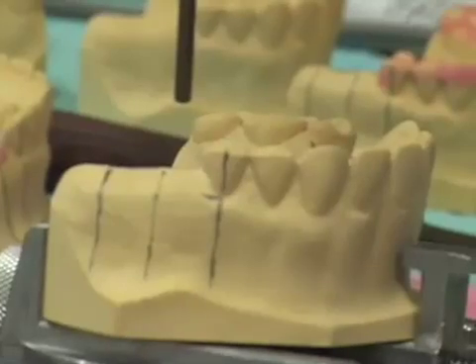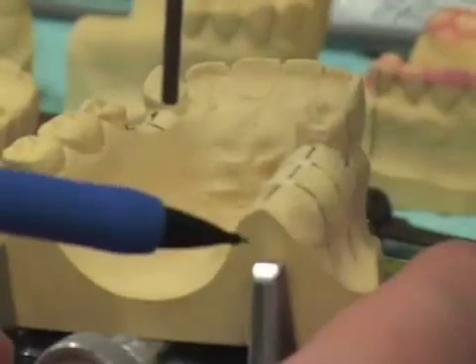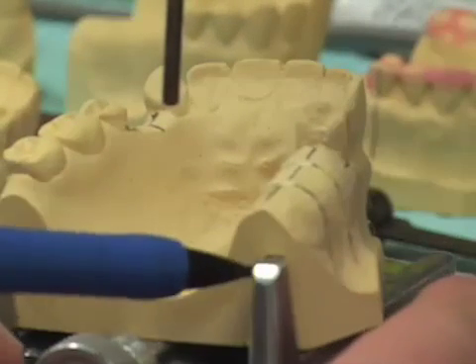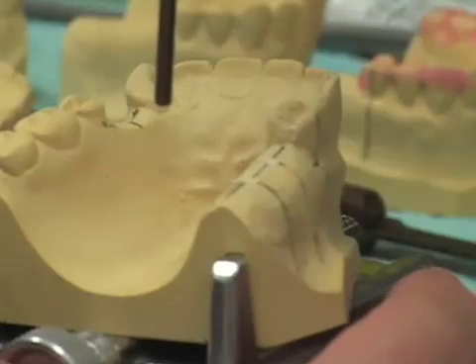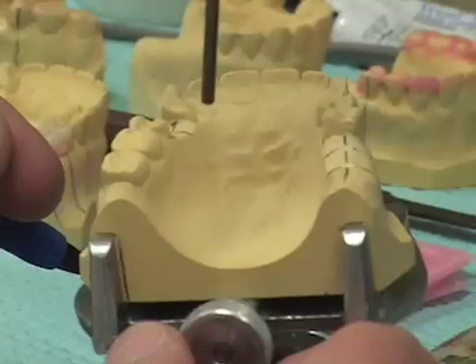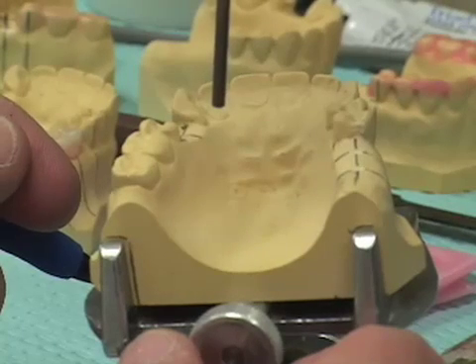I'll take my mechanical pencil and mark on the sides of the cast where the little holding clips held this cast, so that when I take the cast off and on the surveyor table, it goes back on in exactly the same orientation.